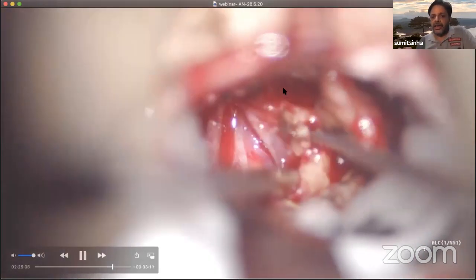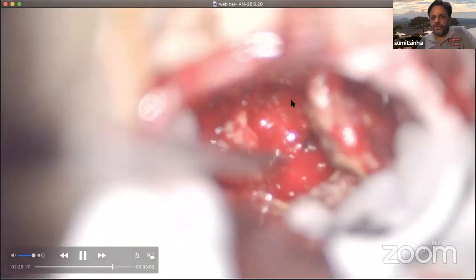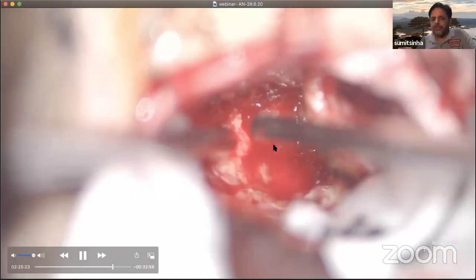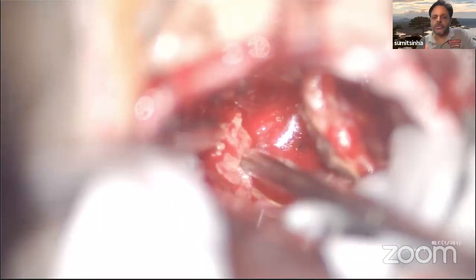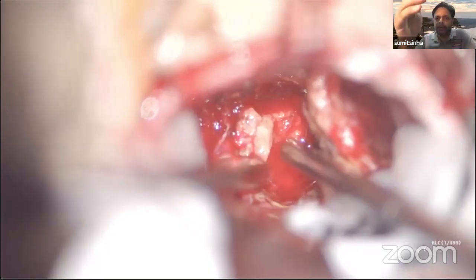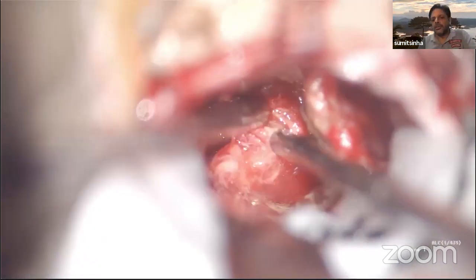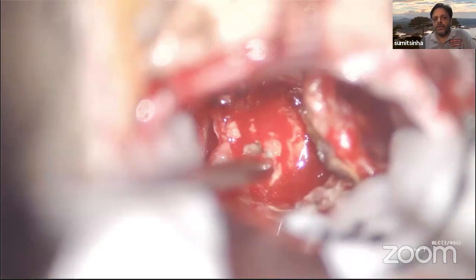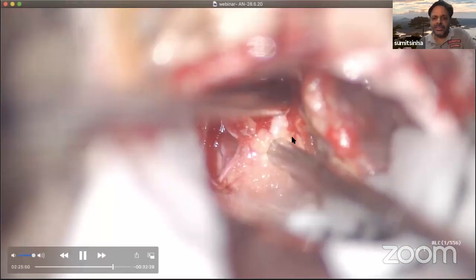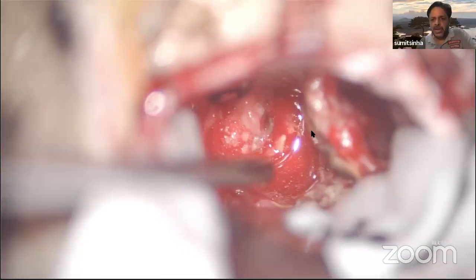After the central decoring, I embarked on the lateral portion of the tumor. I already told you that in this tumor, I did not need to drill the meatus because the tumor is not going that much into the meatus. It is stopping short of the porus. So after the central decoring, I went on to the lateral part of the tumor, removed the tumor from the lateral part at the porus, and then came again to the medial part of the tumor. This is exactly the sequence of events. So the strategy is exactly the same. Yes, for large tumors, completely agree.